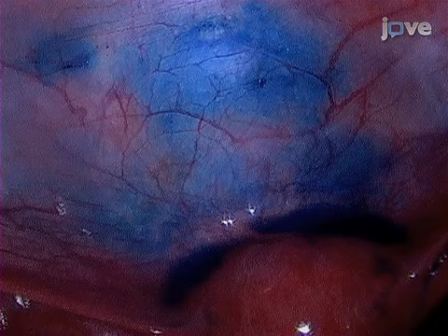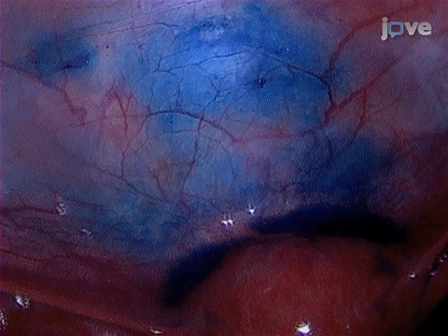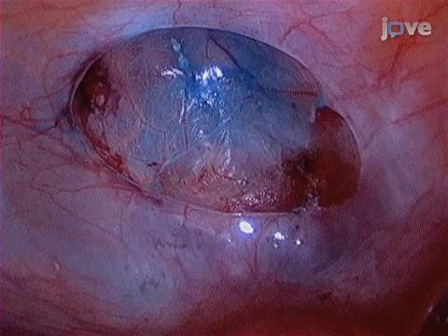As a second step, methylene blue dye is applied, which shows areas of subtle endometriosis that might be missed by normal laparoscopy. Next, all blue-stained areas are resected to completely rid the patient of disease.